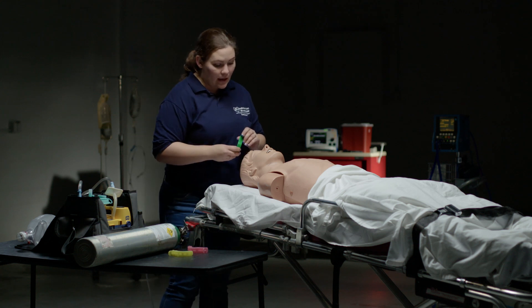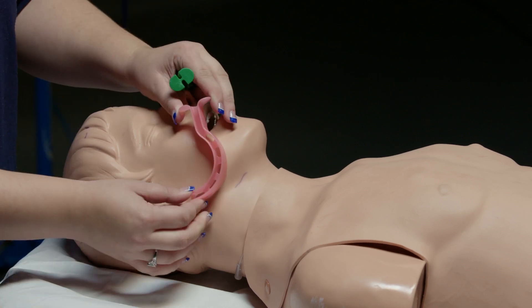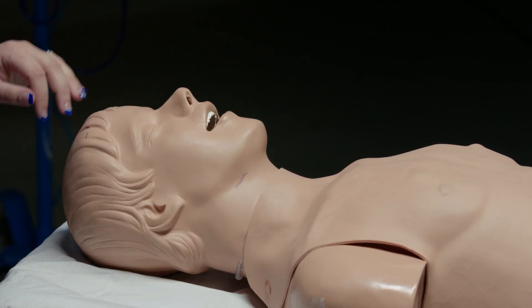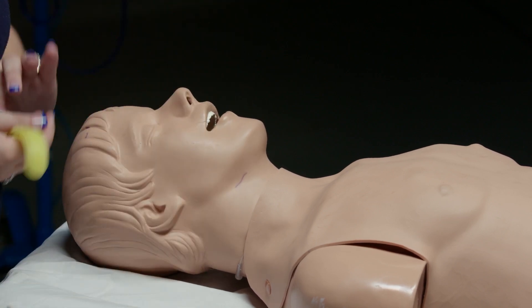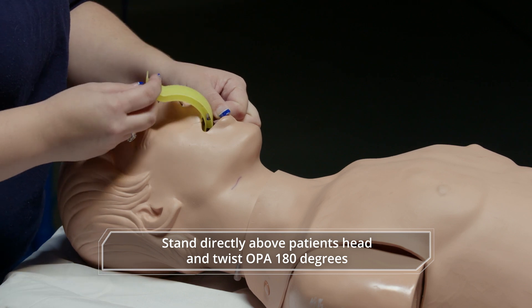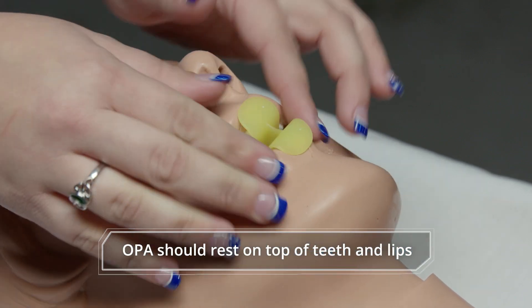I'm going to insert an oral pharyngeal airway. I'm going to measure from the corner of the jaw to the corner of the mouth. This one is too big, this one is too small, this one is the appropriate size. I'm going to use the cross-finger technique to open the airway and insert the OPA curve side down, then twist 180 degrees.